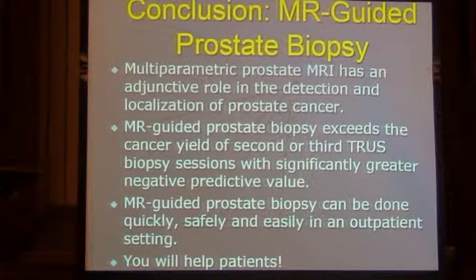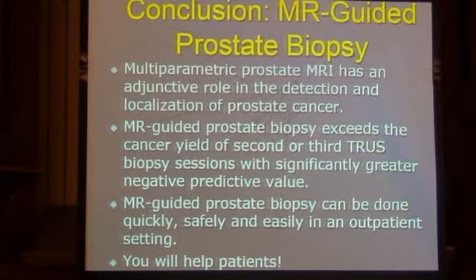The other reason is that there's two other factors that MRI is really key in. One is extracapsular extension. You want to make sure that before you have a radical prostatectomy, it has remained in the prostate gland. It hasn't broken out of the gland and become extracapsular. One of the key ways to find that out is through MRI, because they can get the anatomy of it, they can get the structure. And there is a large group of people at this point that are doing radical prostatectomies without having even found out if it's extracapsular extension. And the way the urologists find out, or the surgeons find out now, is when they get in there. And you can avoid radical prostatectomy in a lot of cases to find out if it's extracapsular or not, because a radical prostatectomy is not going to do you any good if it's extracapsularly extended. So MRI is another way to stage it properly.